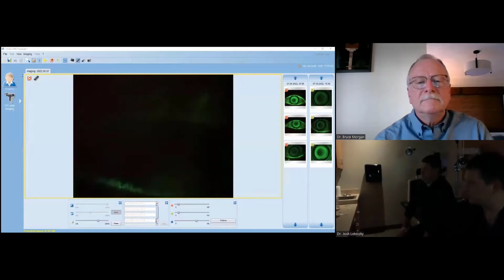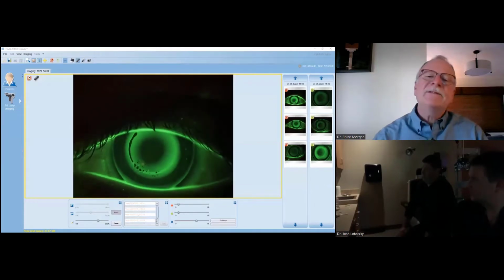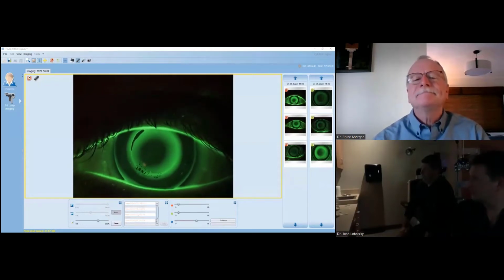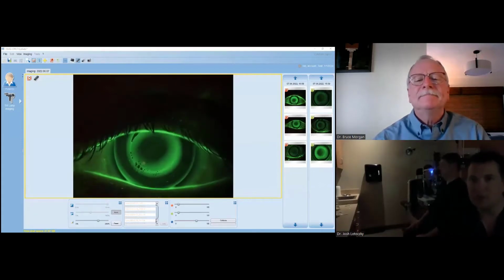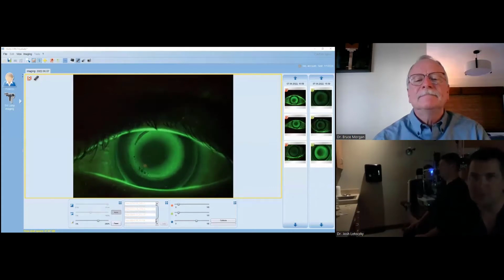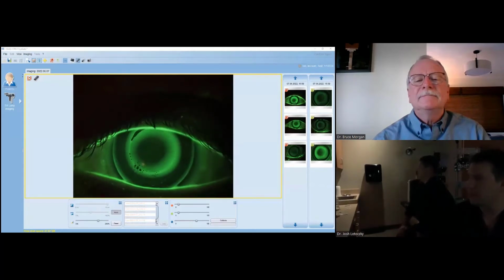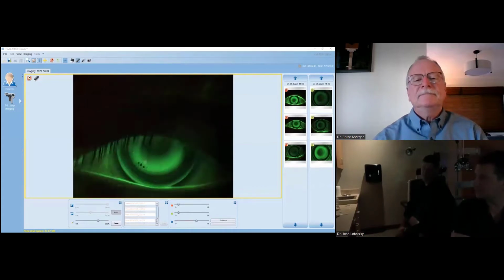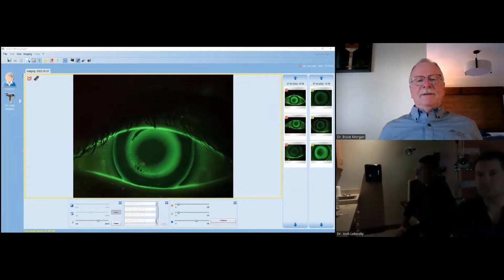This one's just interesting to see because it just keeps moving its way. You can see it moves its way and spreads itself out. Yeah, I would say under closed eye condition, that's probably going to go away in a matter of minutes. And you can see additional ones coming and going when you look at that 7 o'clock position where it was before. Now you've got a bunch of separate ones. I would think this would naturally go away once they've slept in the lens. Yep. But you see that we've got a bigger treatment zone already. It's still not a perfect fit, but it's bigger treatment than the last one we had on the eye. Definitely.